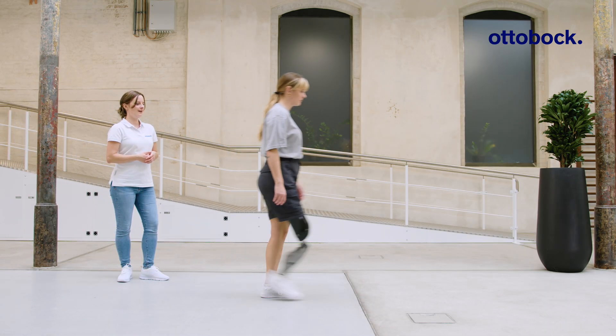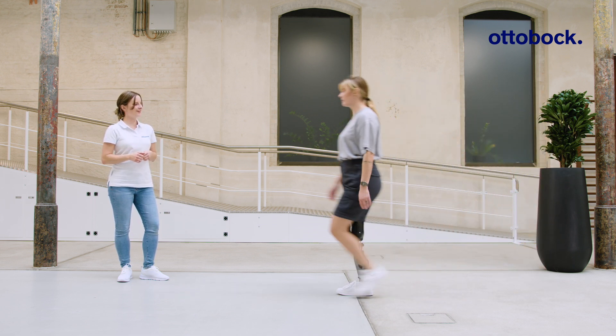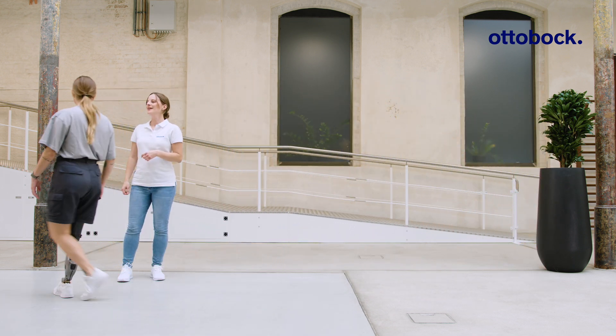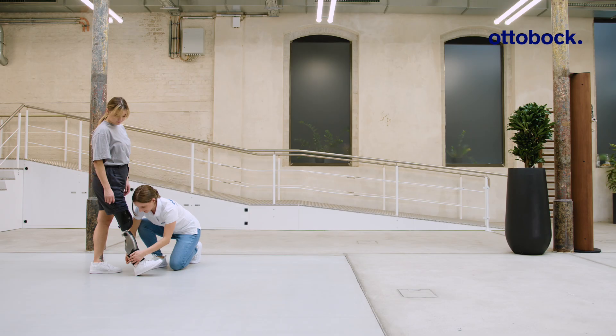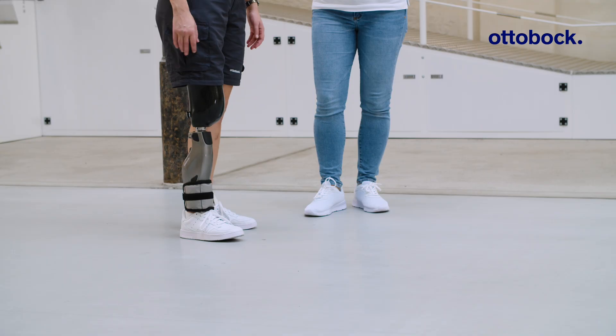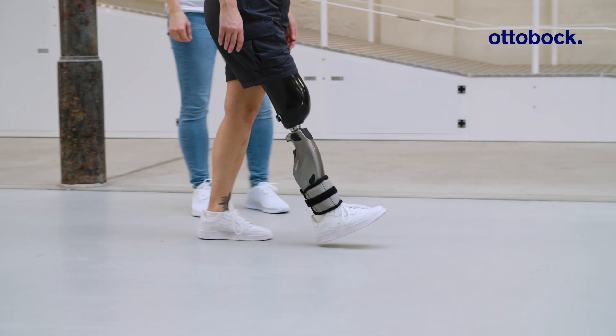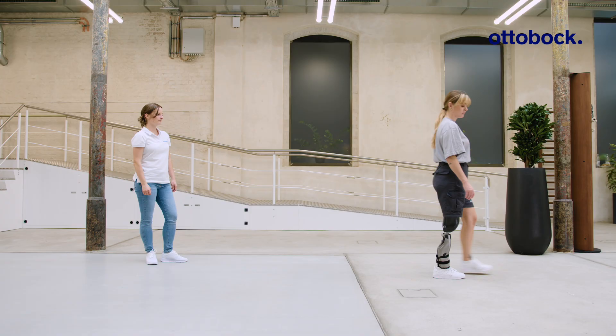The Genium X4 automatically adjusts its swing phase behavior when the walking speed or the weight of the shoe changes. When additional weight is added, the knee joint adapts its swing behavior within just a few steps. This adaptation ensures proper toe clearance and an optimal position of the prosthetic knee joint before heel strike.